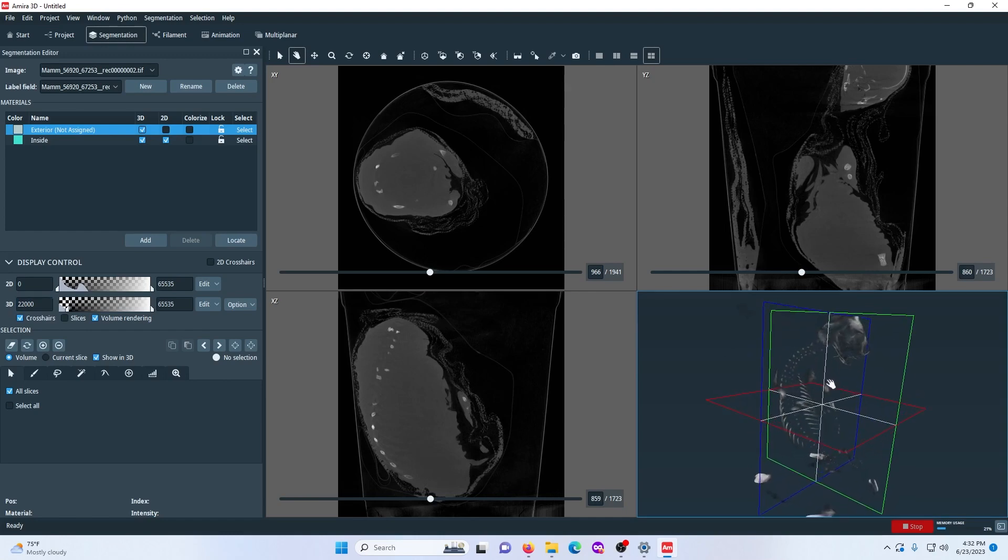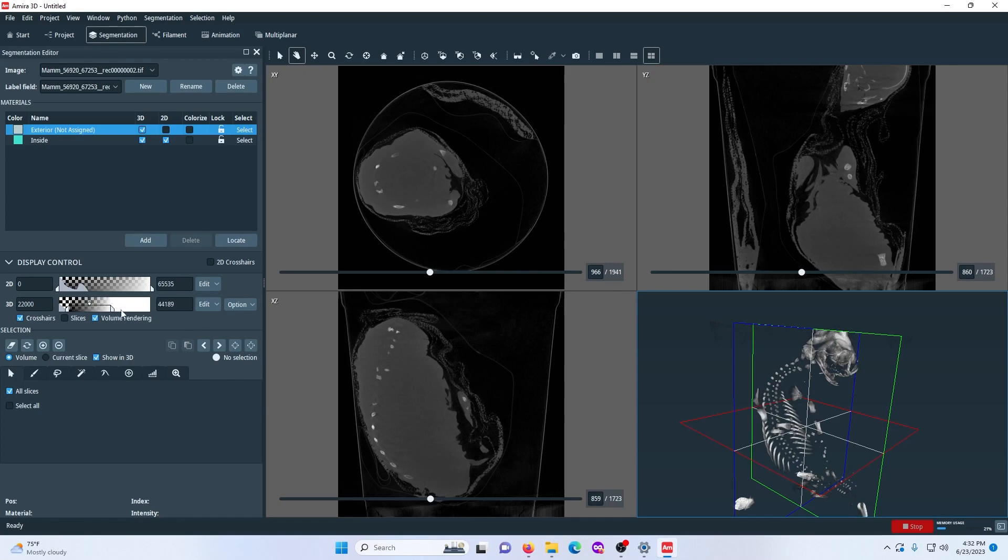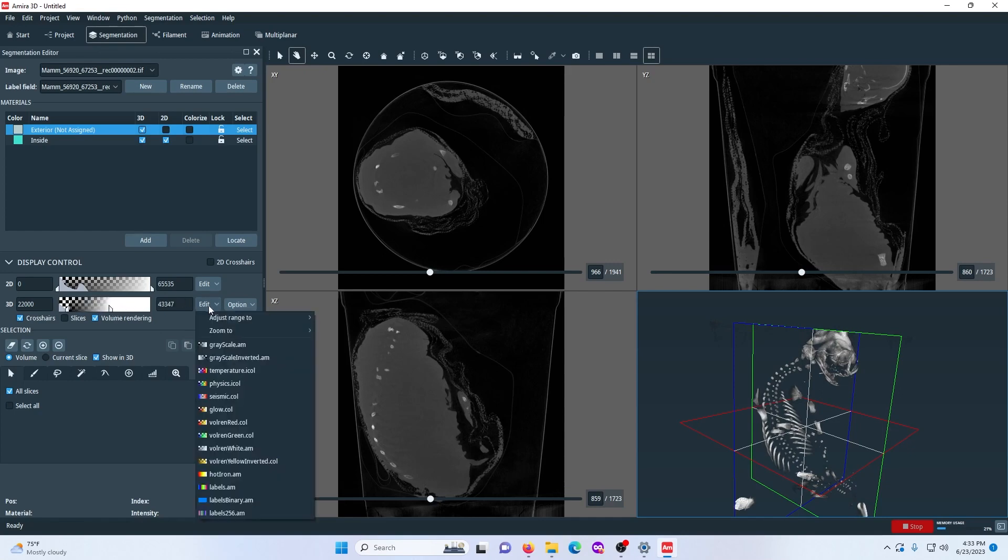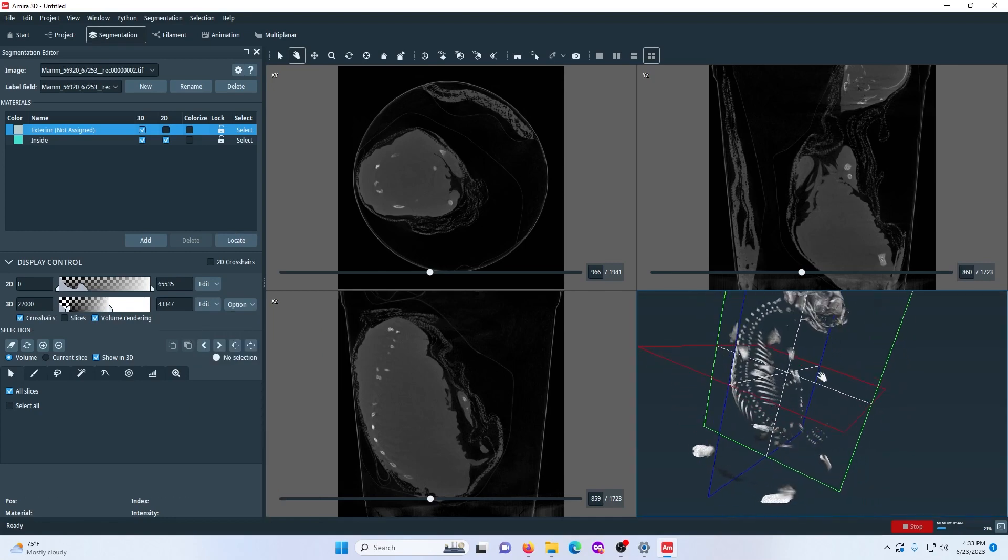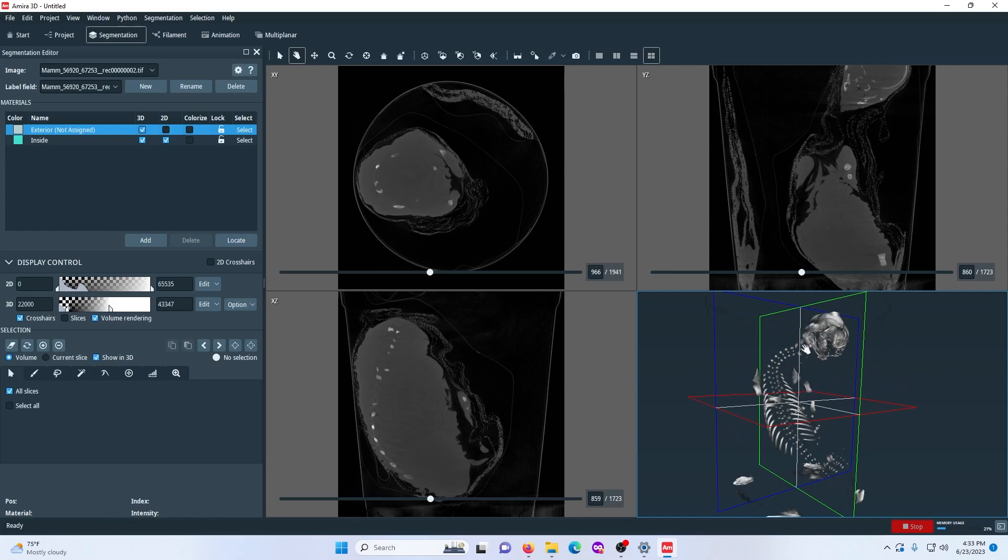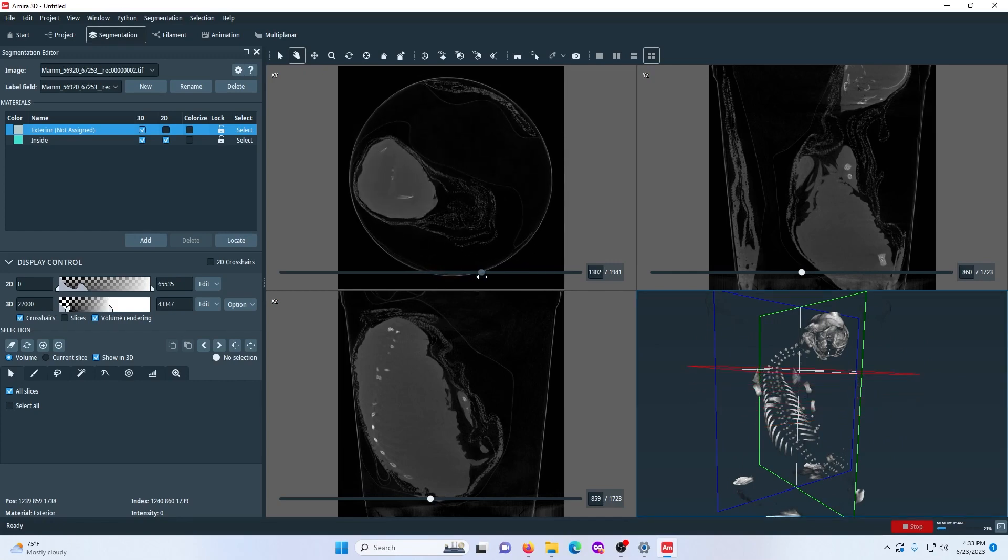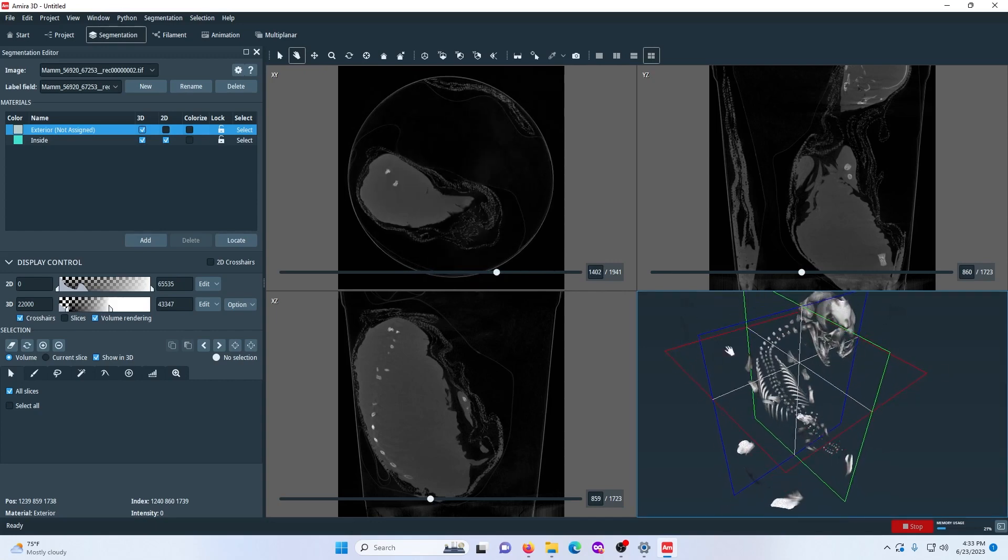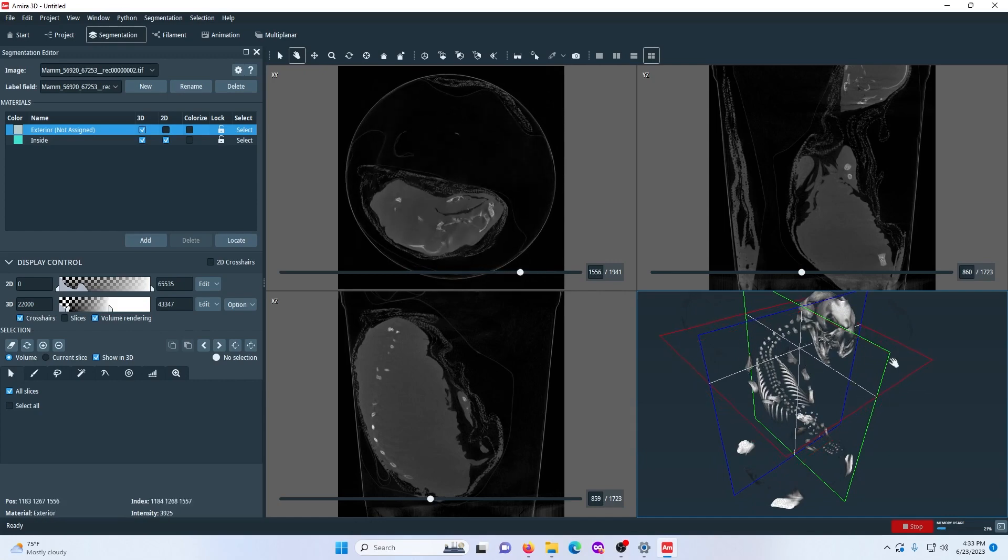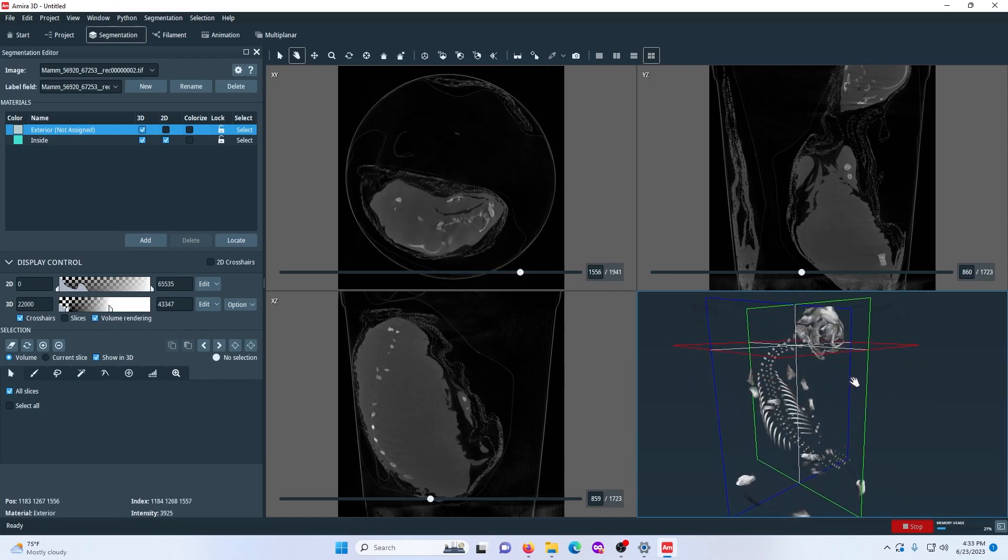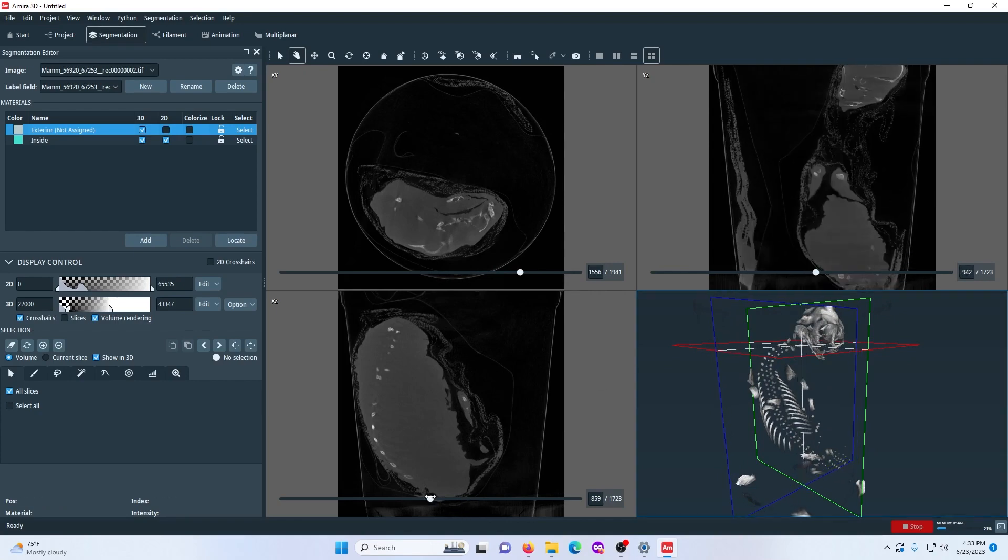So I usually put this at around 16 to like 22,000. And there you go. That filters everything that's not a bone, or like as hard as bone, basically. You can see that you play with the right slider and it makes things more or less visible because these are different. This basically just adjusts the gradient. And you could use different gradients here, but I recommend generally sticking with the default grayscale because that's what works for me. The top left one here is the red plane and you're just looking at like a cross section basically. So if you sliced it, let me actually go up to the skull. If you sliced it like perfectly along this red plane, then you'd get this image and the same goes for the blue plane and the green plane.